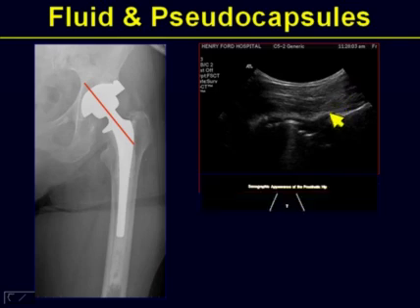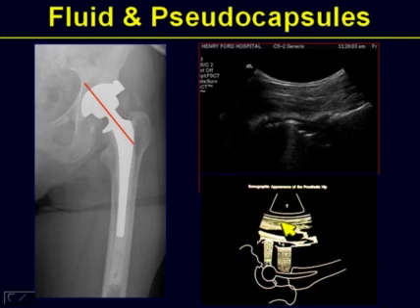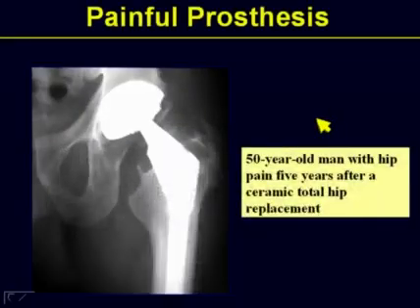We do like to address that because here the probe is on long axis view. Note that you'll see the metallic prosthesis. So any abnormal collection of fluid distending the pseudocapsule at the intertrochanteric ridge is the area that we're going to take a peek at.